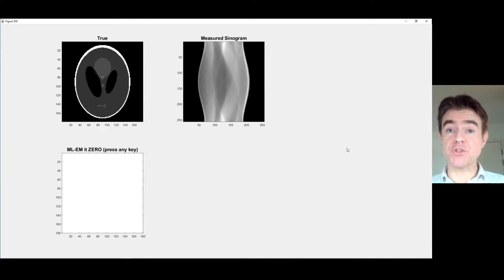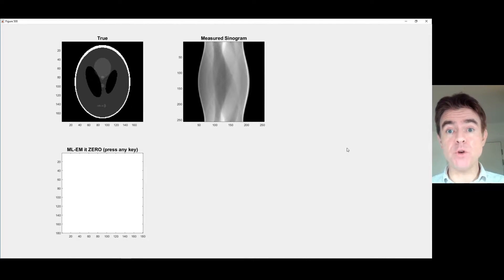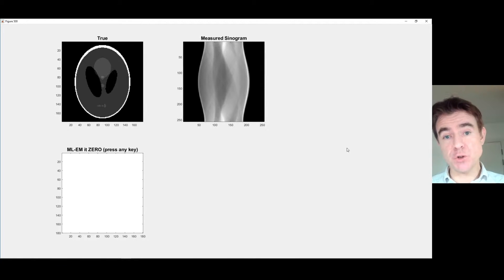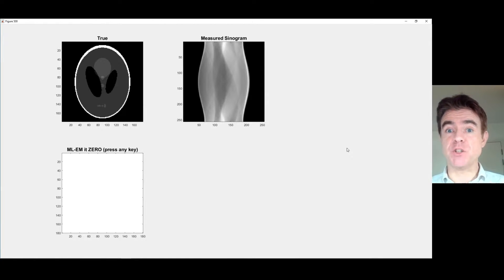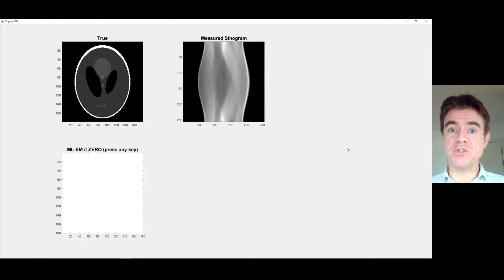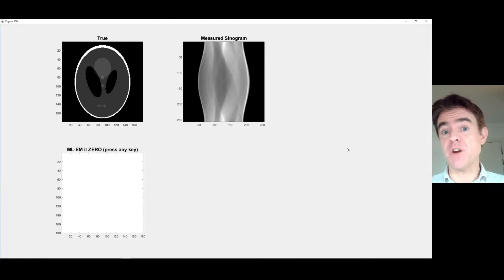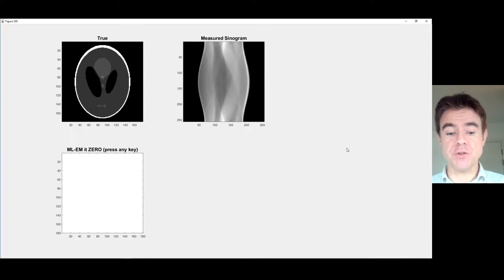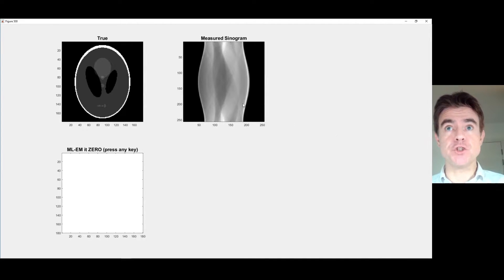In this video, I'm going to present how to code in MATLAB a simple iterative image reconstruction algorithm. It's called maximum likelihood expectation maximization, but here we'll just focus on the simplicity of implementation of a very straightforward, robust, iterative reconstruction method.